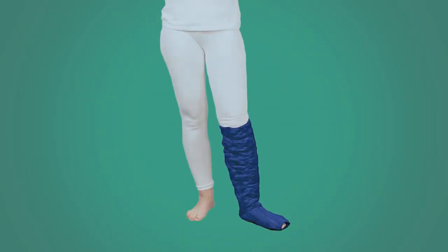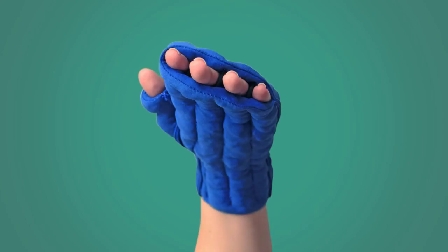We have arm garments, lower extremity garments. We have gloves that have digit spacers in them as well, so if you have a patient that has finger swelling. And we have a wrist to axilla garment that can be worn in conjunction with either the glove or the gauntlet.